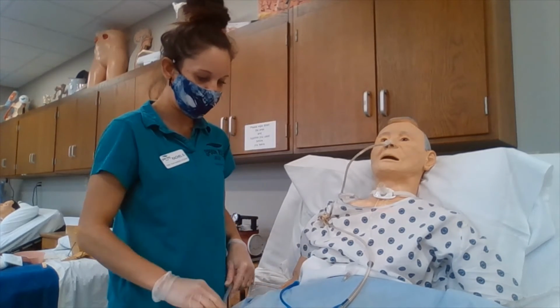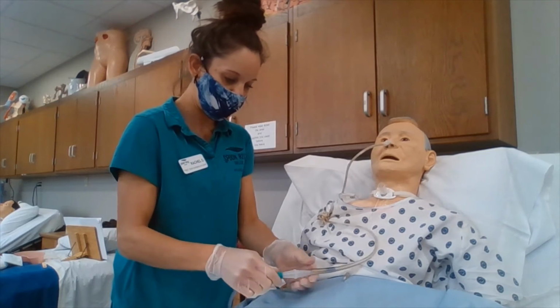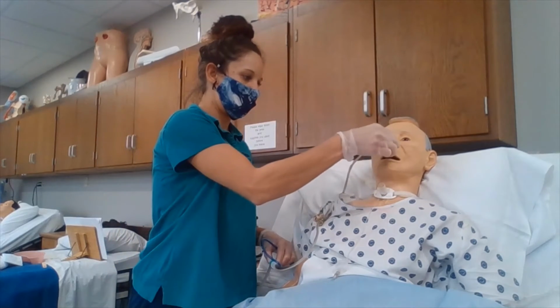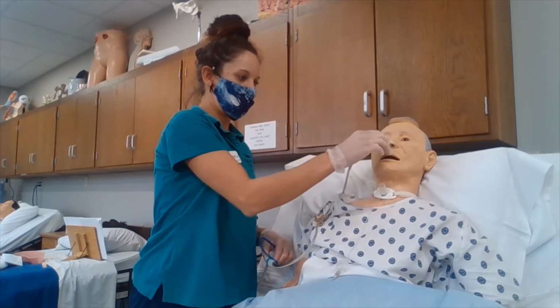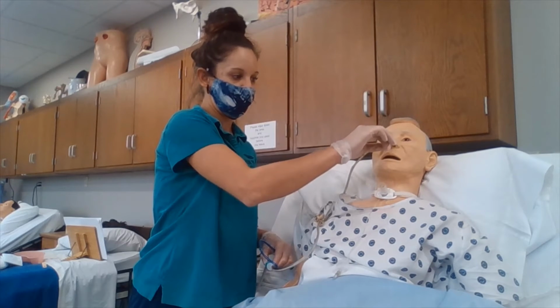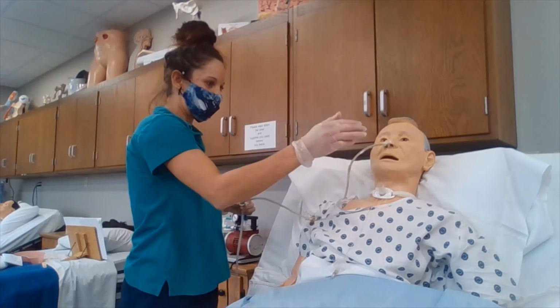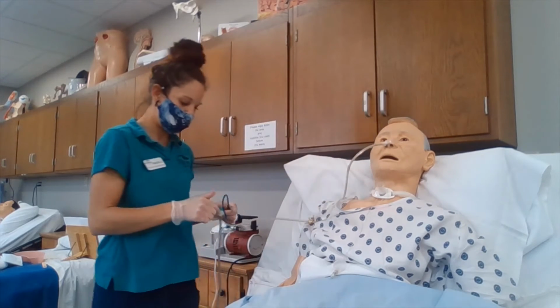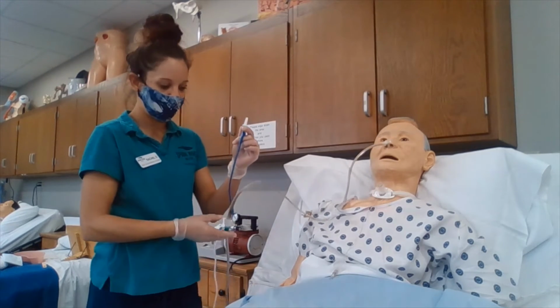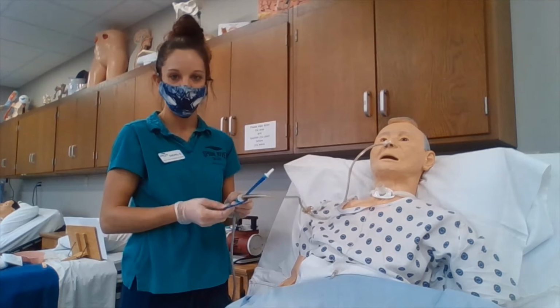We would turn on our suctioning to the proper amount. We are going to make sure that we have the measurement marked where the tubing is placed. We are also going to measure the tubing to the connector and record that as well. And then we are going to perform proper maintenance on the tubing according to agency policy.